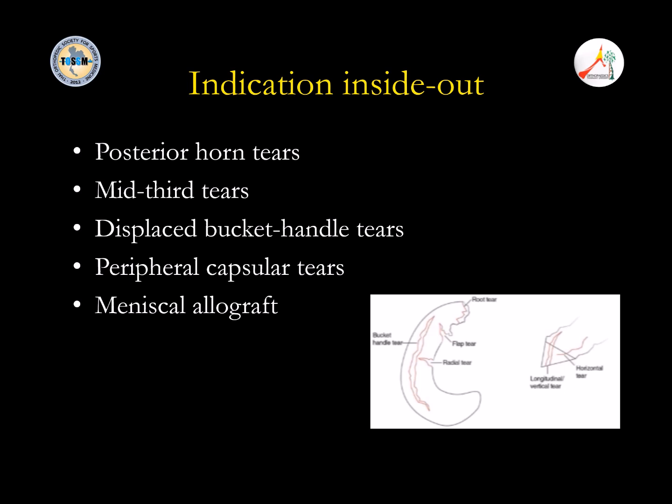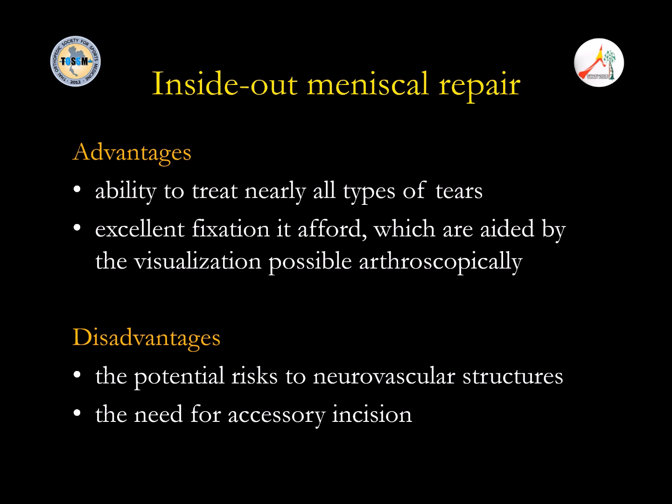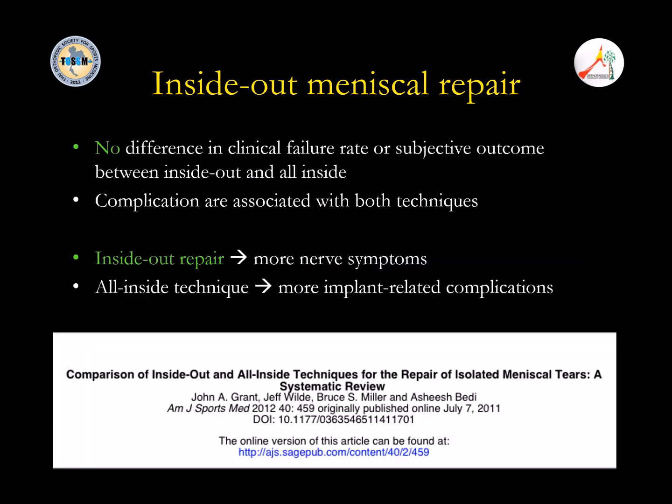Peripheral capsular tear, meniscus allograft: we use inside-out for these. The advantage is the ability to treat nearly all types of meniscus tears, excellent fixation, and it is also cost effective. The disadvantage is the risk to neurological structures, because you need to put the needle from inside to outside. So some areas are quite dangerous. I need an accessory incision. There's no difference comparing inside-out and all-inside from this article. But with inside-out you have some problems with nerve symptoms, especially on the medial side, where you have the saphenous nerve in this area. That is the common complication.